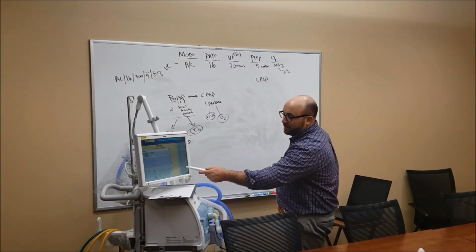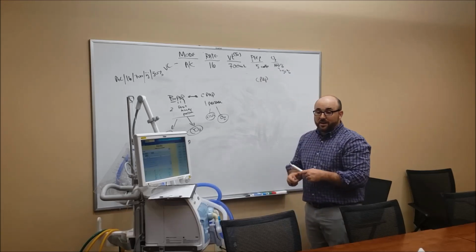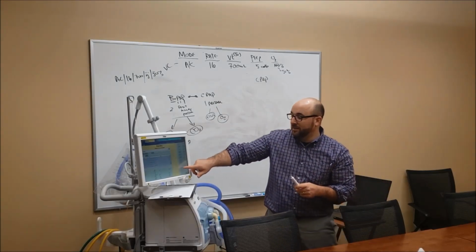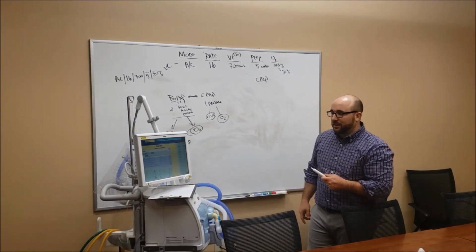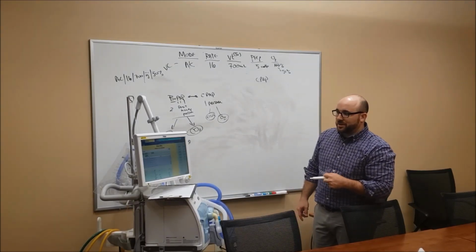And the button below it says manual, inspiratory, and a hold. You actually can hit this and it gives them a breath. It's like bagging them, like giving them extra breaths. So the other ones you probably won't deal with that much.